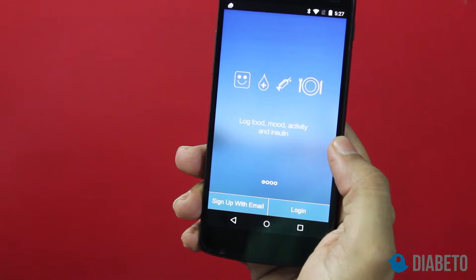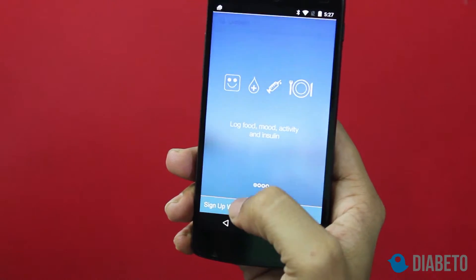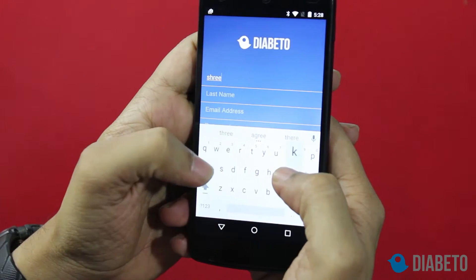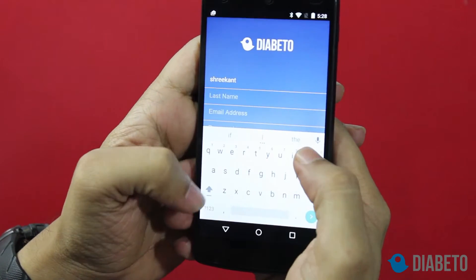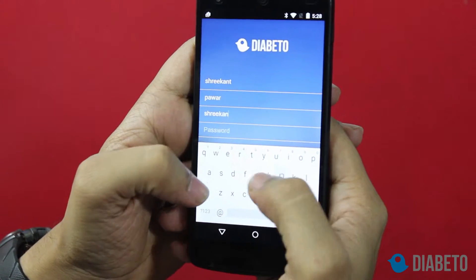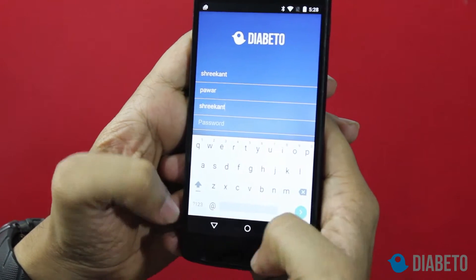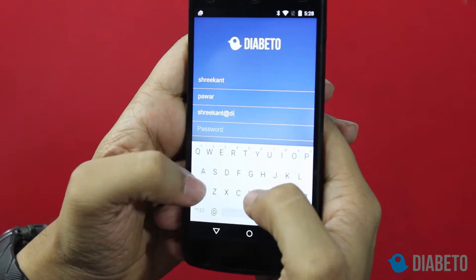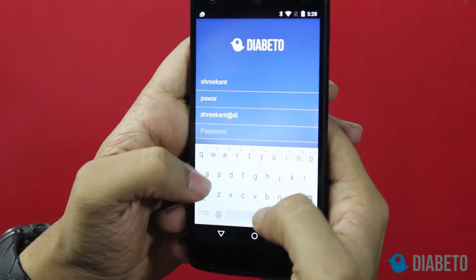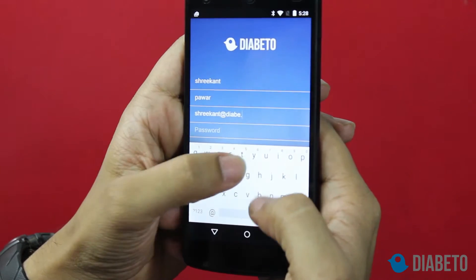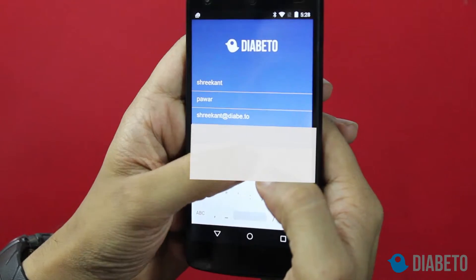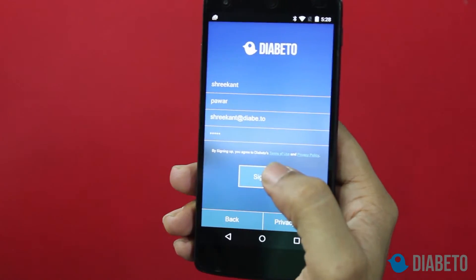I've downloaded the Diabito application and now I'm going to sign up. I'm going to enter my first name, my last name, and my email address. And my password — I'm going to set my password now and sign up.